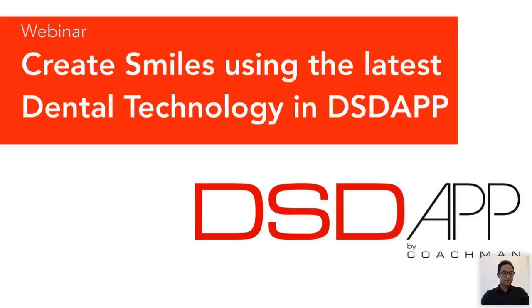Today, I'll talk to you about how technology can help you analyze facial structures in order to deliver harmonic smiles. So let me share my presentation with you right now. Perfect.